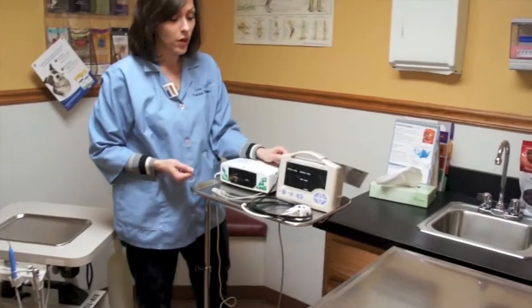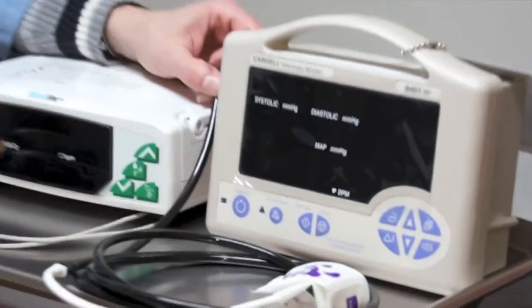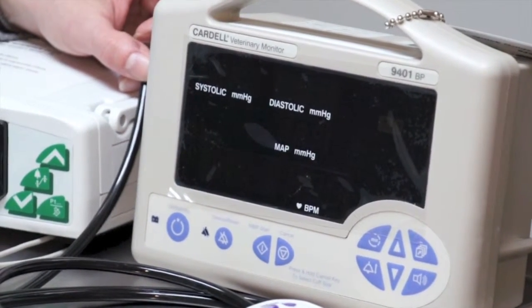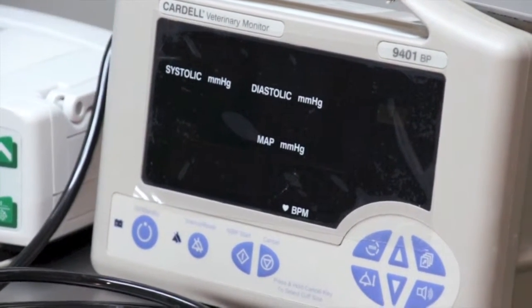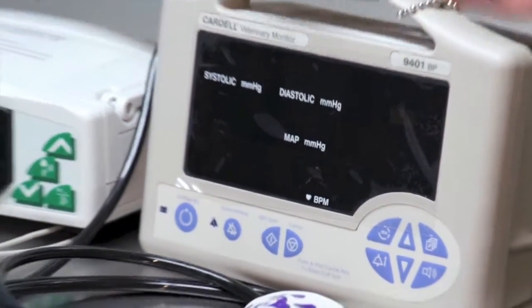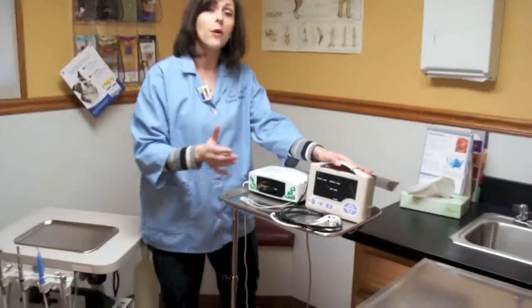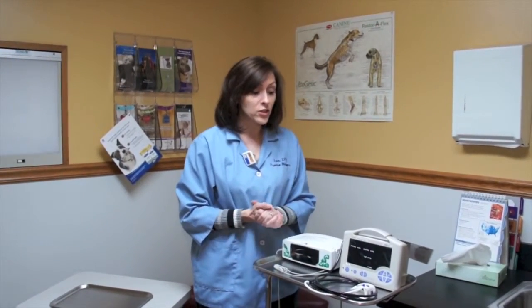Finally, another monitor that we're going to be using is a blood pressure machine. This is nice because it gives us the two readings for our blood pressure, systolic and diastolic. Our systolic reading is actually going to tell us the pressure in the arteries when the heart is contracting. And the diastolic is going to give us the reading of the pressure in the arteries when the heart is at rest. During, again, anesthetic, our patients can actually have a low blood pressure, so it's very vital that we are watching them during the time they are anesthetized. There are other different types of monitoring devices that you can use, but today these will be the two that we will be using for our dental procedure, so let's begin.